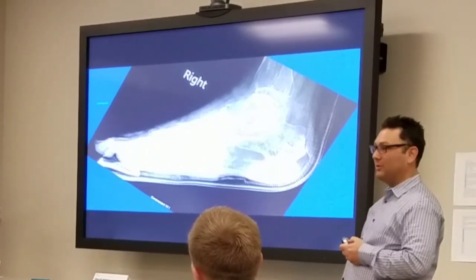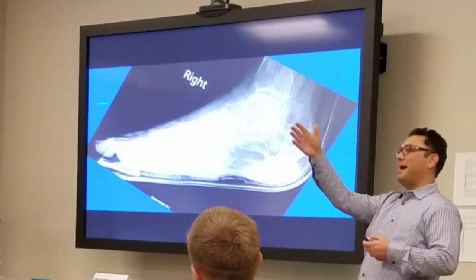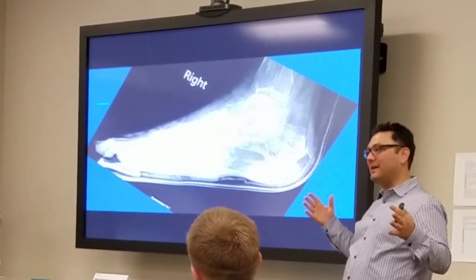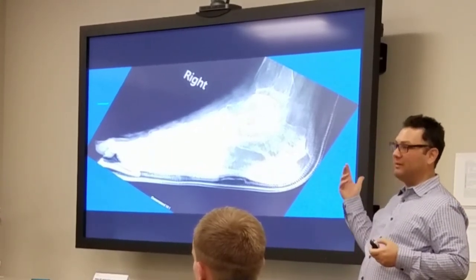You win some, you lose some on these. These are not bunions, they're not predictable. In a sense, you do full correction and then you go back to 35 degrees of supination. Does that make sense? The real smart biomechanic guys can explain how one unlocks the other and unlocks the other, but a lot of that doesn't even end up adding up.